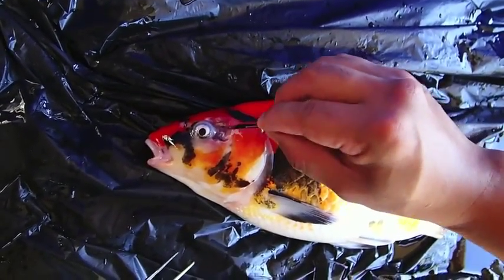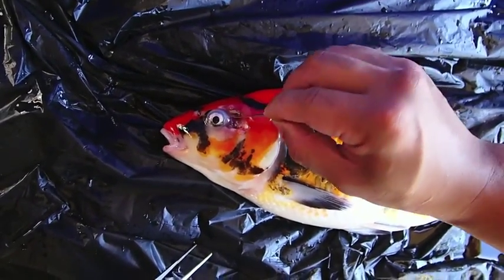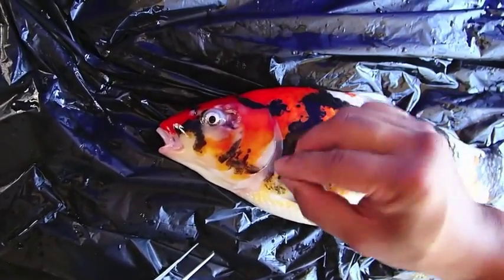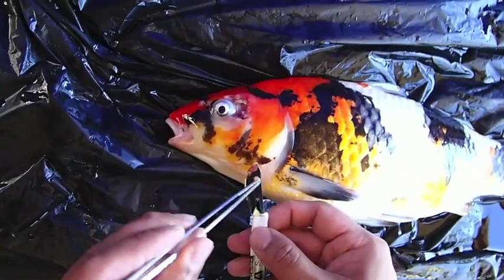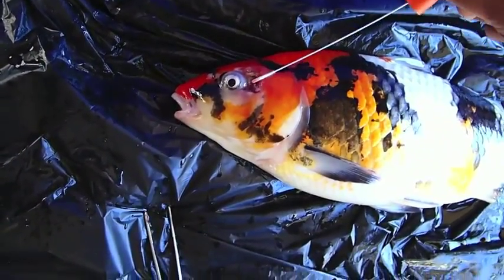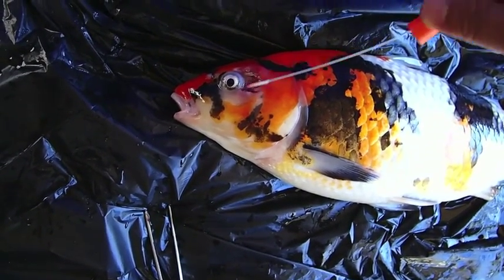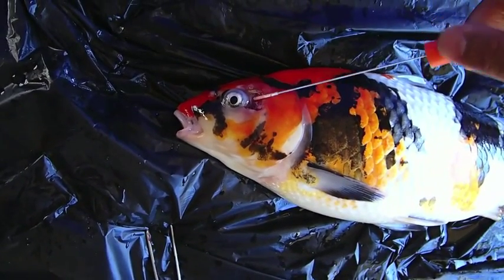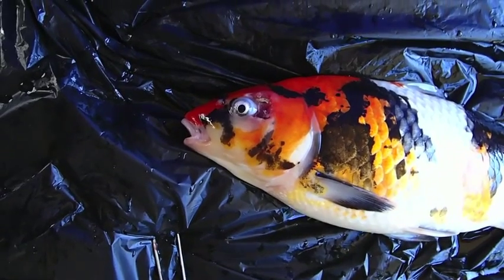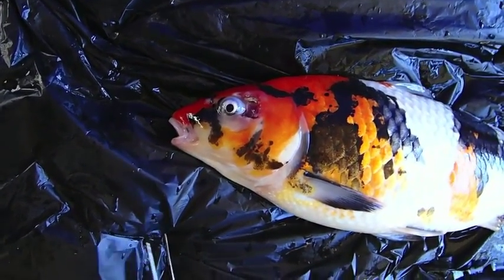Here on this koi, you can see there is a huge defect behind the eye — a huge ulcer. So what we are doing is scraping the ulcer to remove all the dead flesh. We will then take a swab to see what bacteria is growing there, to determine if it is a primary or secondary bacterial pathogen, and also to run antibiotic sensitivity, so we know what antibiotics to use or whether we may need to change if the bacteria is resistant.